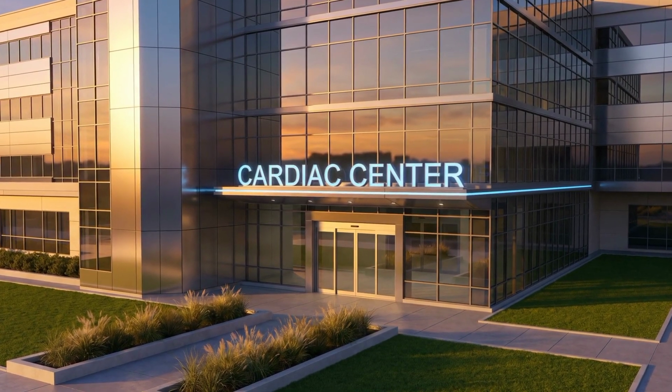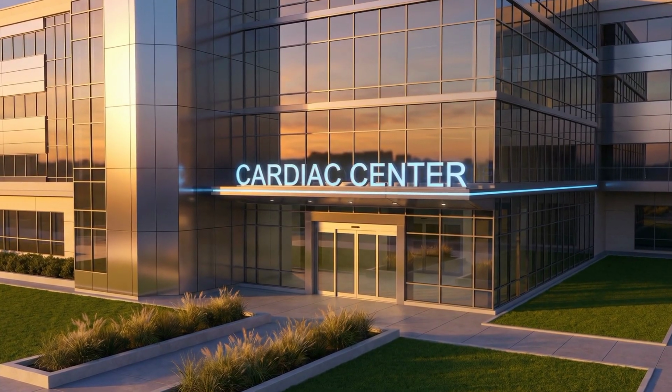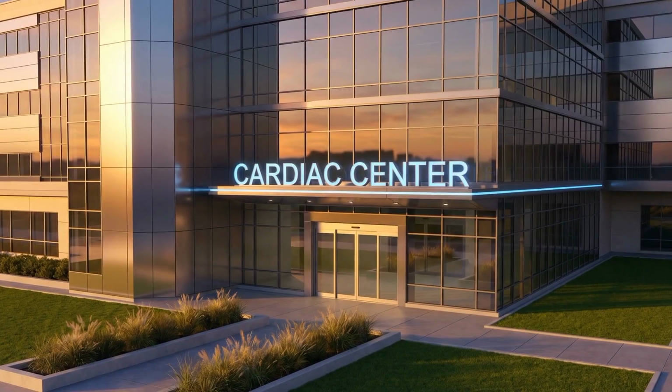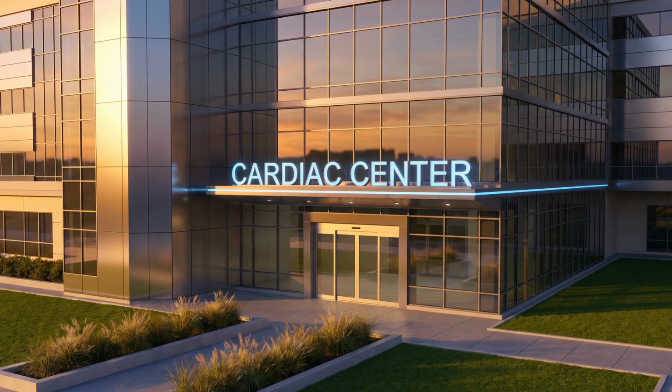Today, let's understand one of the most important setups in a modern hospital, that is the Cath Lab. A Cath Lab, or a cardiac catheterization laboratory, is a specialized room where doctors diagnose and treat heart problems using minimally invasive procedures.